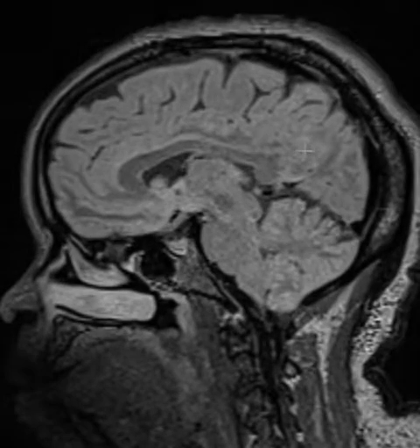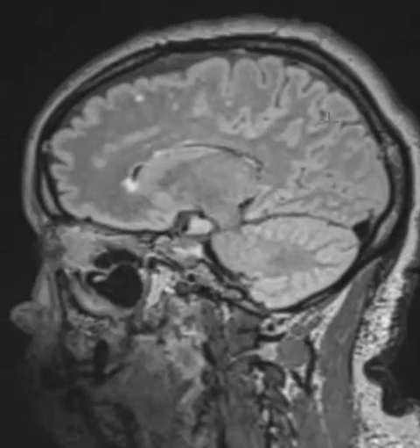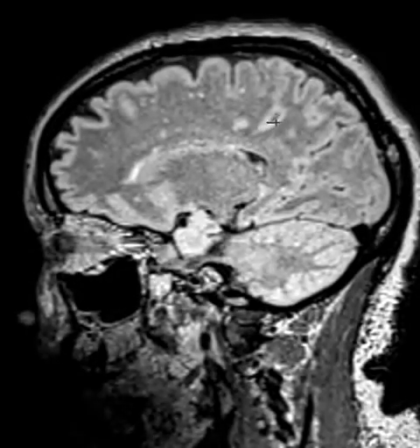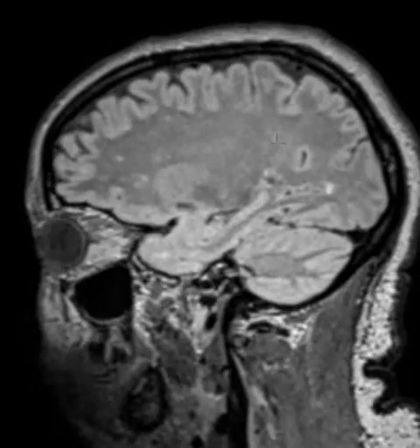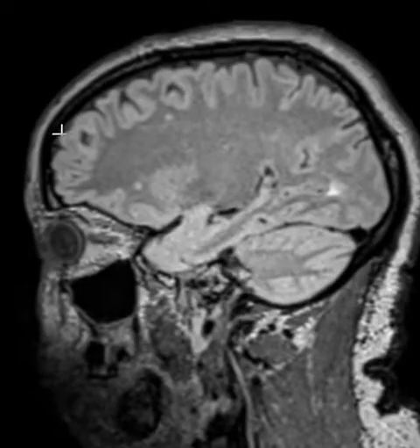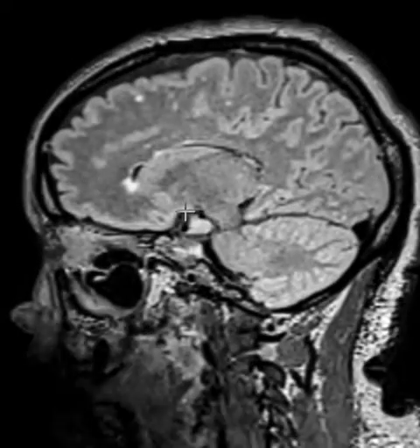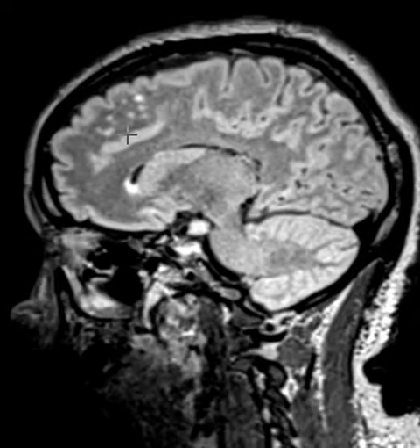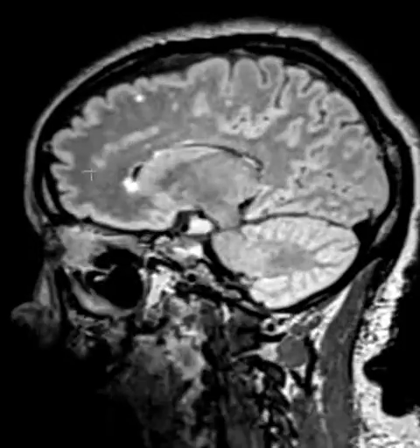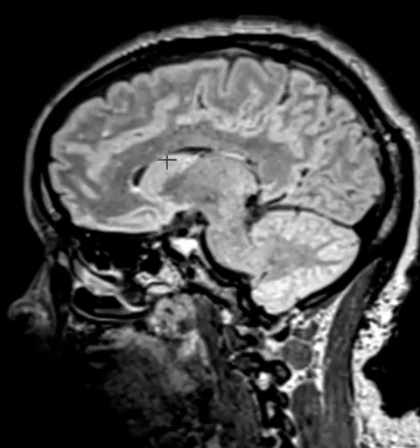She's had MRIs in the past that describe white matter lesions typical for migraines, and this examination again shows white matter lesions that are pretty classic. I want to show you a straightforward example of white matter lesions that may be related to migraines and fit her clinical picture. This is a sagittal view — the top, front, back, with the neck pointing downward — and we see in the brain lots of little specks scattered around. These specks are not in the gray matter; they're in the white matter, which is the dark uniform part of the brain.